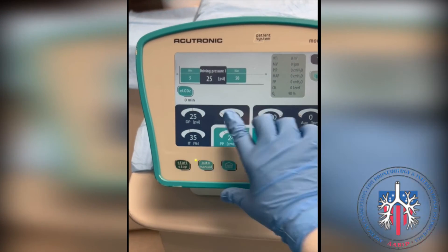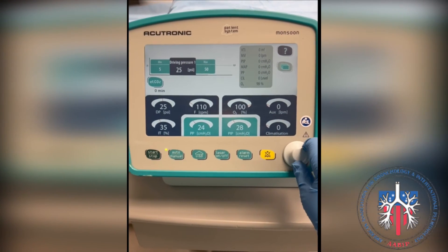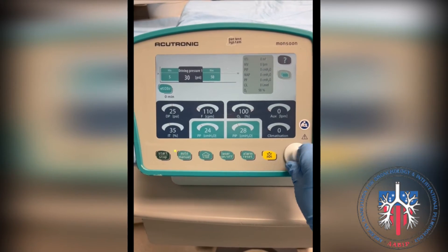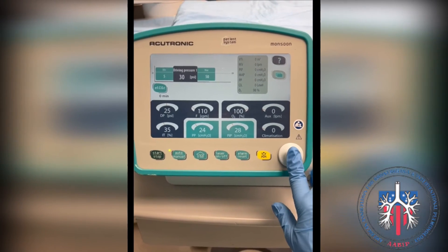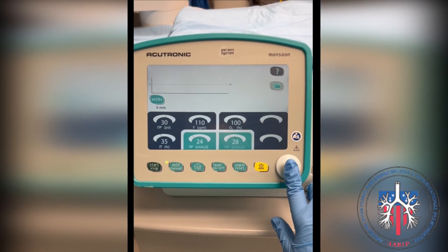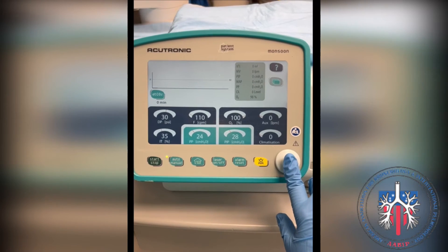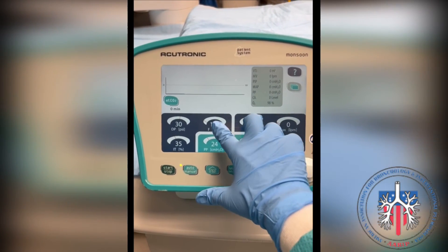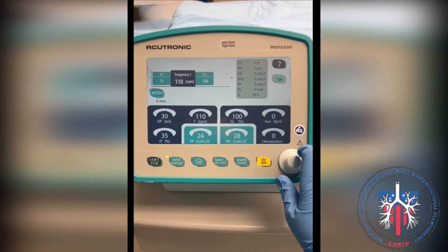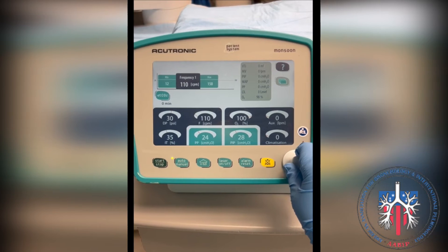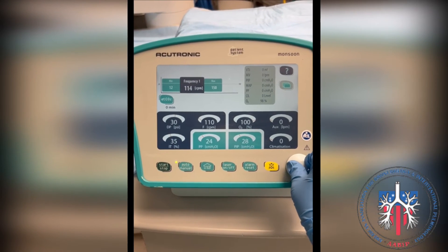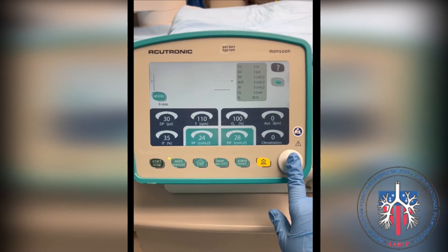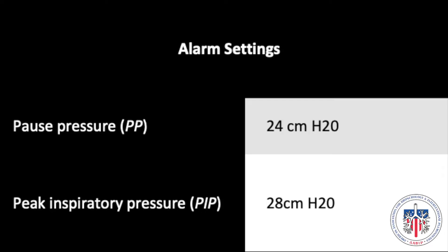To adjust the driving pressure, press the screen button as shown and adjust the pressure with the knob. Push the knob to set the pressure. Do the same thing to adjust the frequency. Press the knob to set the frequency.